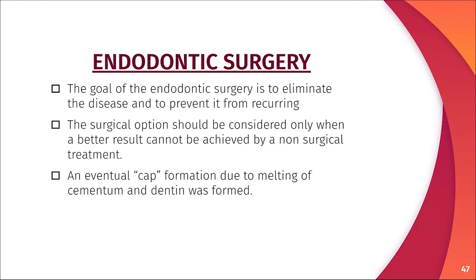Endodontic surgery. Laser can be used in endodontic surgery. When a non-surgical treatment does not give a better result, we go for surgical treatment. When we use laser in endodontic surgery, an eventual cap formation occurs due to the melting of cementum and dentin.